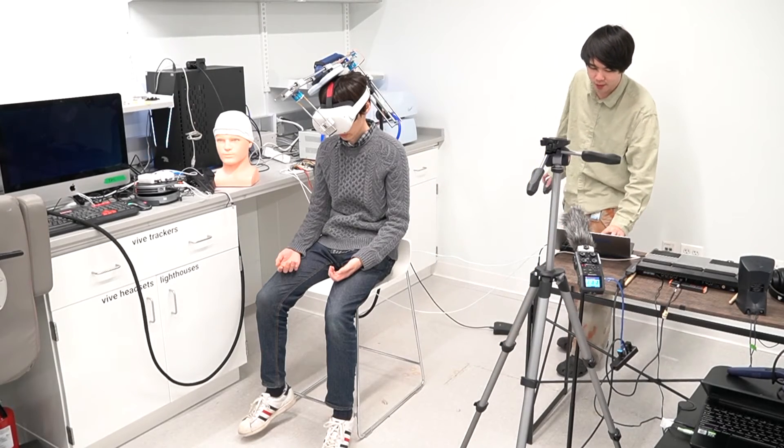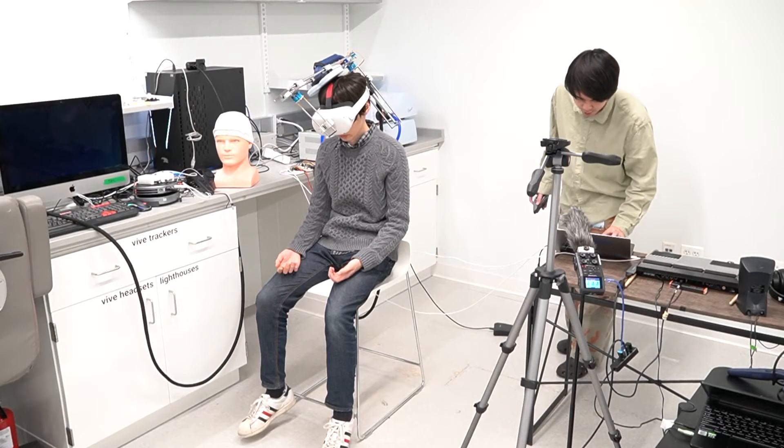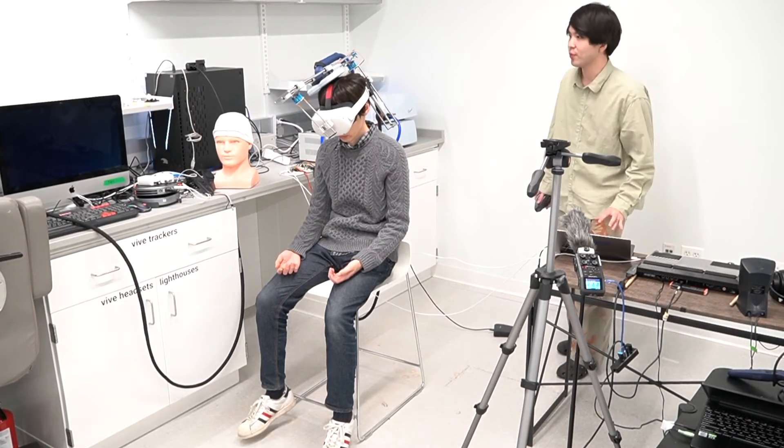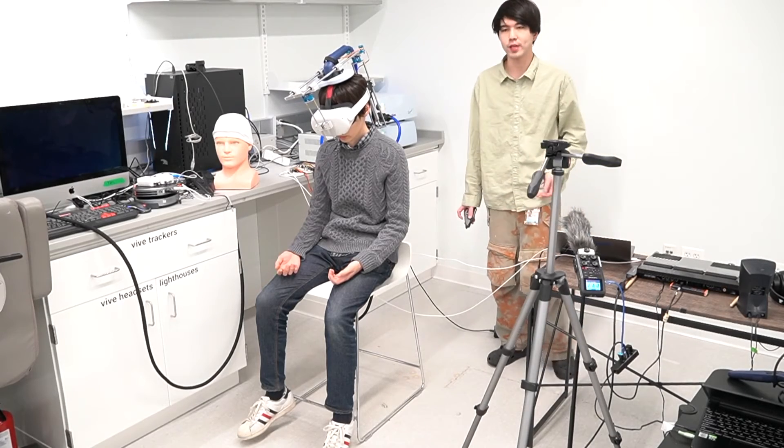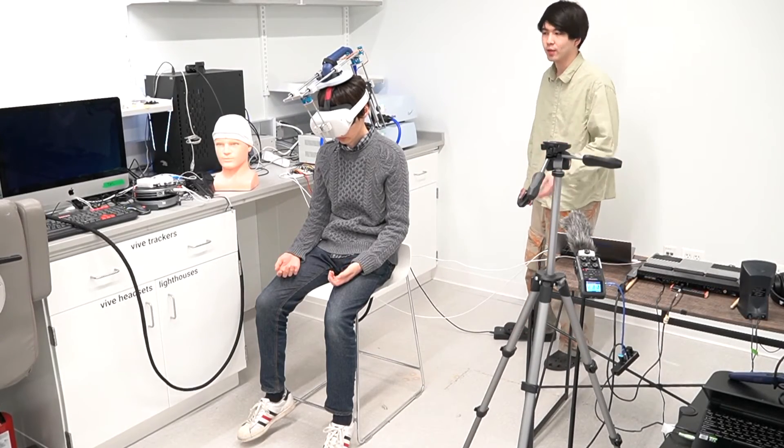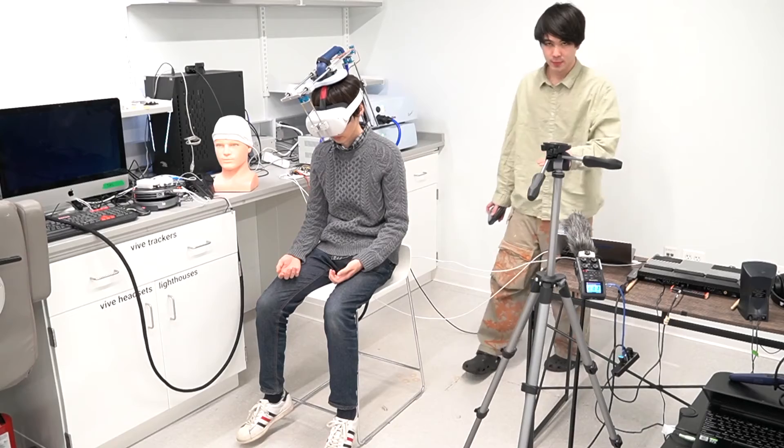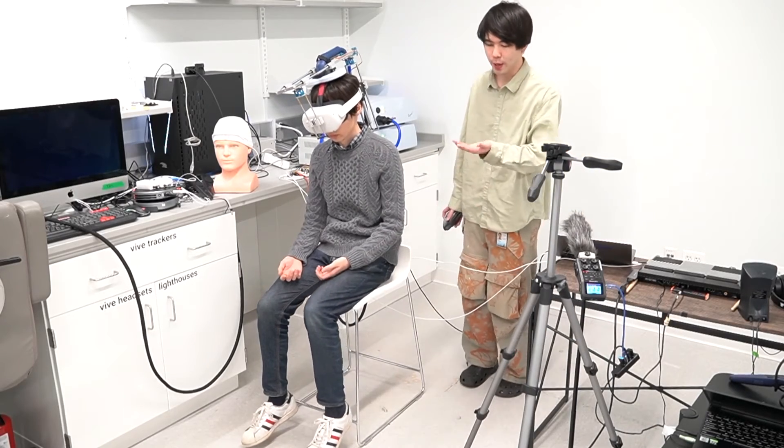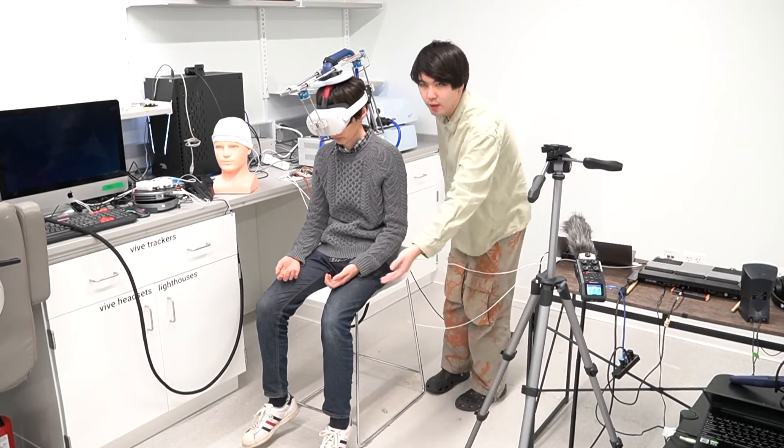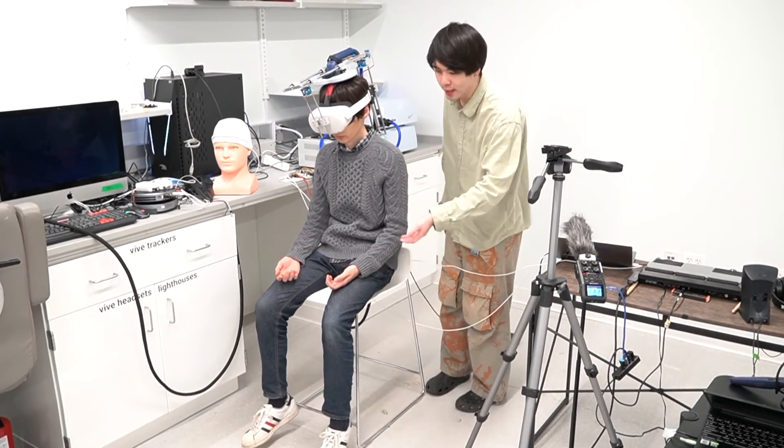And now let's move this coil to another location this time around, to the brain area that corresponds to his left foot. And again, I stimulate. In the same principle, you saw it, his whole leg now moves and he felt the sensation in this area.